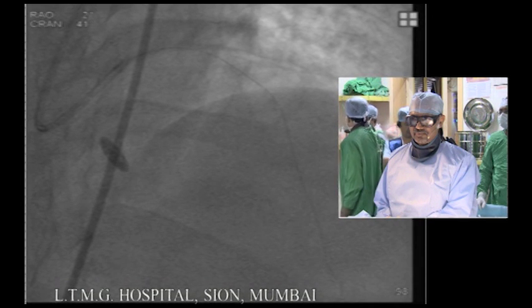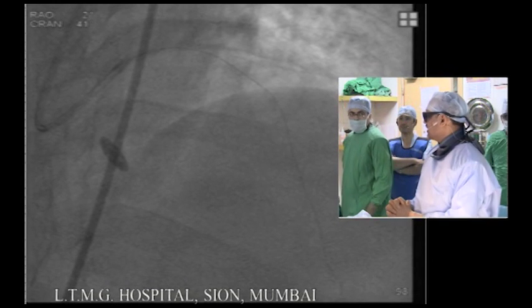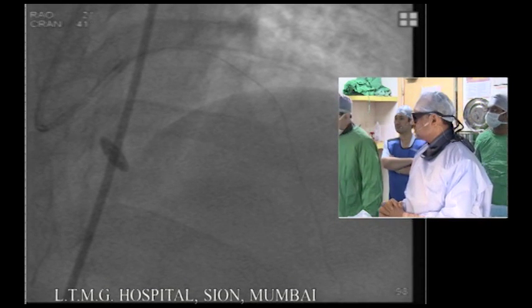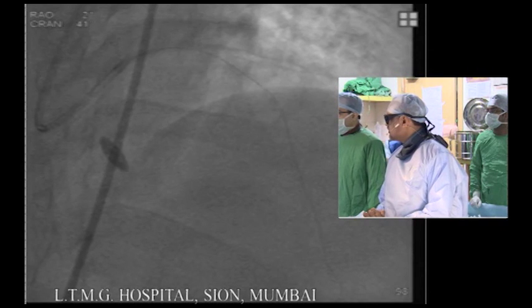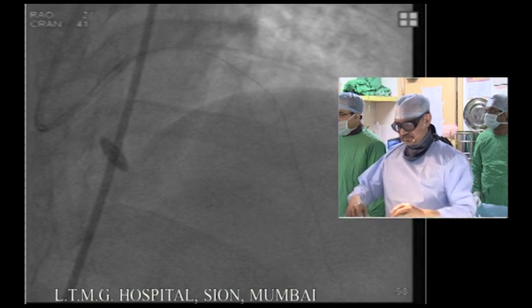Okay, I will tell you in the next case we had a problem with such a stent in delivering this stent, and we used a non-compliant balloon up to 24 atmospheres for pre-dilatation. In the second case, what I will show you in a few minutes, but maybe this would be a good option for this case. So going with a non-compliant balloon first.